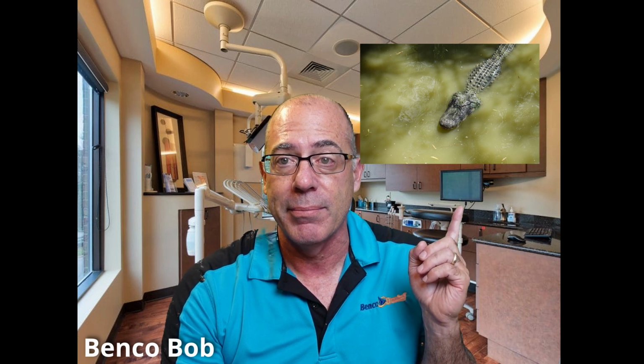Have you ever had a patient say that the water that came out of your handpiece, your air water syringe, tasted funny or smelled funny, or if it looked like this? Minus the alligator, of course. If the answer is yes to that, then there's a good chance that you have a biofilm problem in your dental unit.